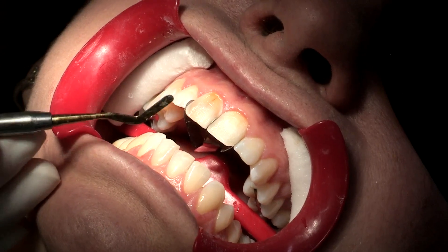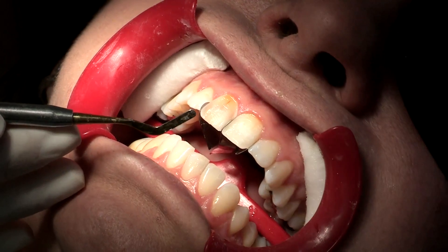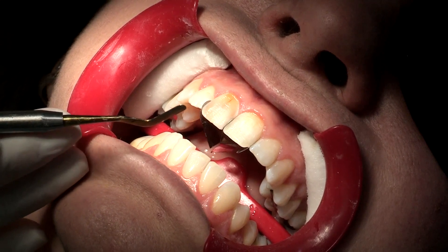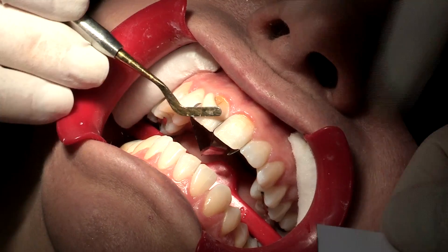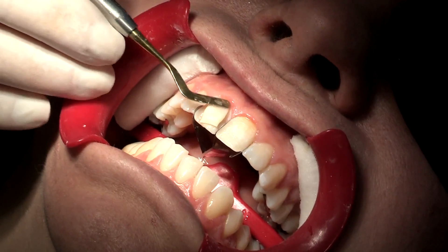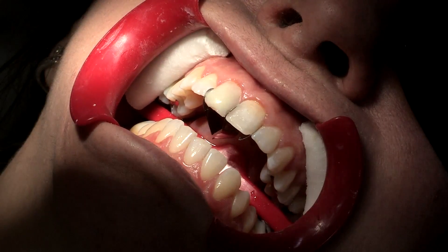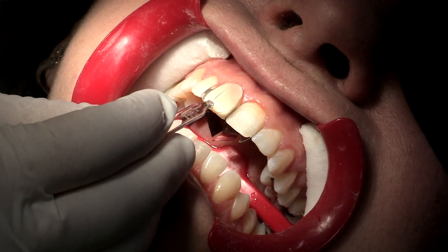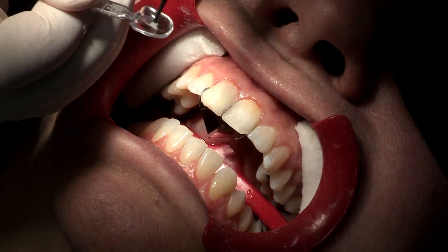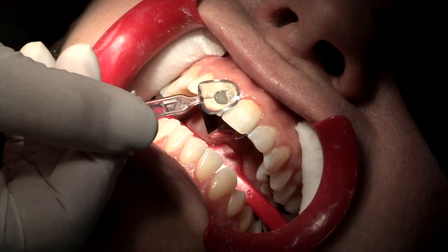And then we apply the composite. In this case I will use Amaris O1. I like the opacity of the Amaris — it has a very good masking ability and it also has a nice fluorescence. I just apply it freehand on the tooth. Then I choose the right template of the UVeneer, which in this case was the large one. I'm going to put a little bit of flowable composite in the middle — just a dot, not too much. We don't want to overflow.